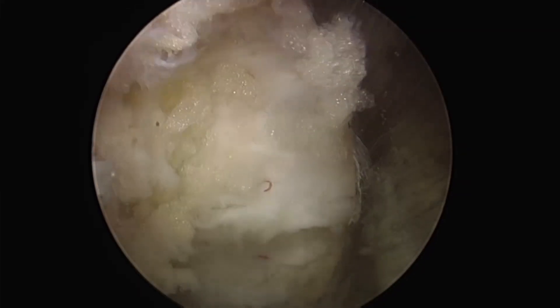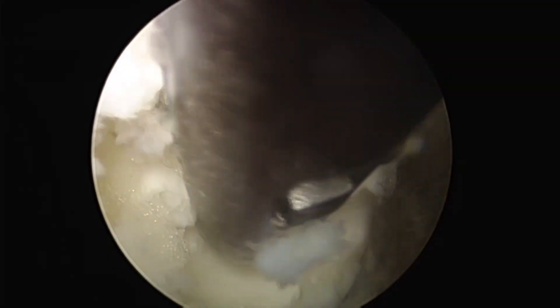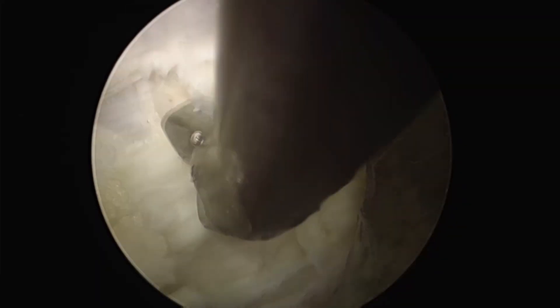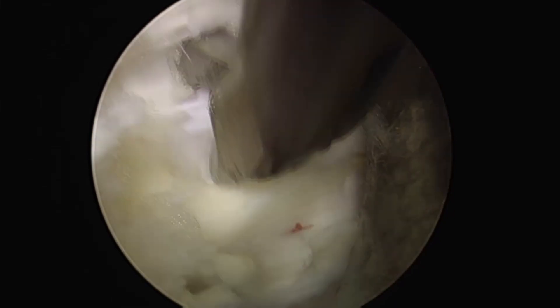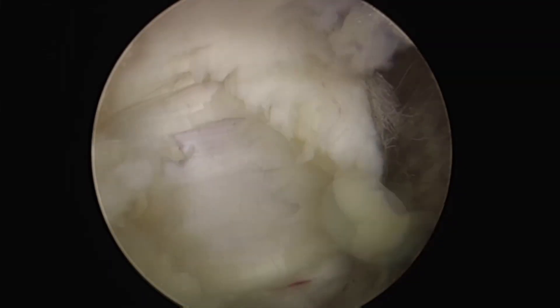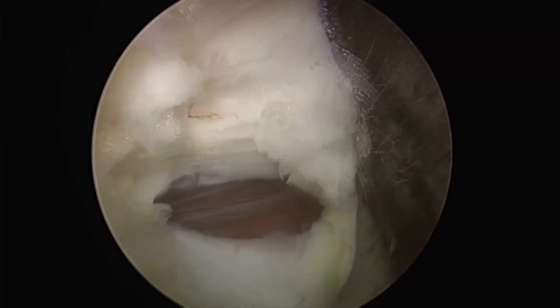After removing the superficial layer, the deep layer will appear. Removing it carelessly with the punch increases the risk of dural injury, so I remove it with a long-jawed basket punch. It is preferable to make the hole closer to the midline, because the dural matter extends from the dorsal side to the ventral side, and inserting the Kerrison long jaw closer to the midline reduces the risk of dural injury.